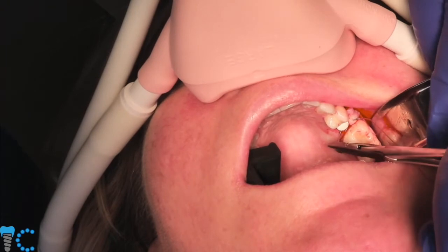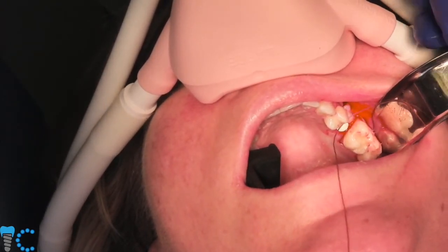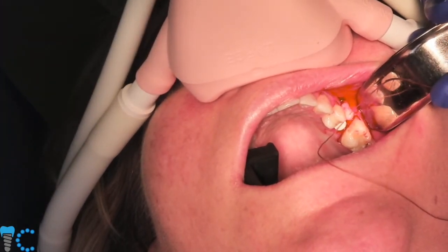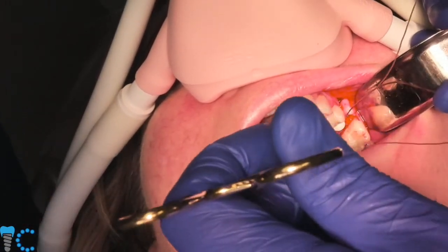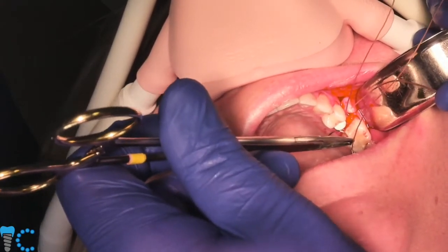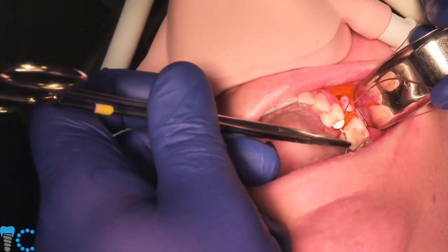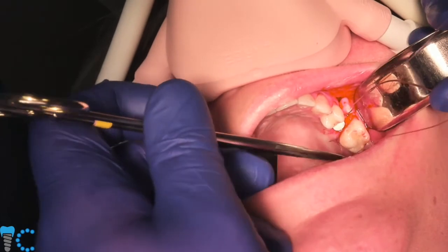So the laser modified implant is really a unique feature. Yes, it is. They're the only company that does that. And again, they came up with this because you can't really treat the surface of a ceramic like you treat the surface of a metal. So they came up with a very clever strategy to increase the surface area on what at the time was a novel implant material.